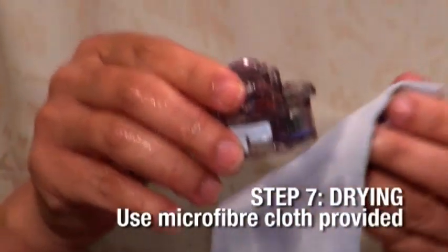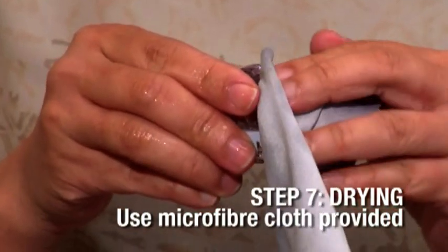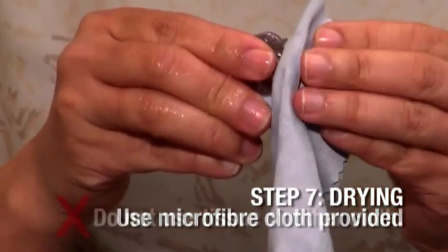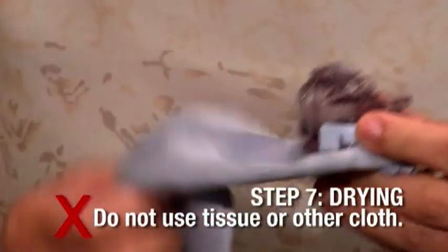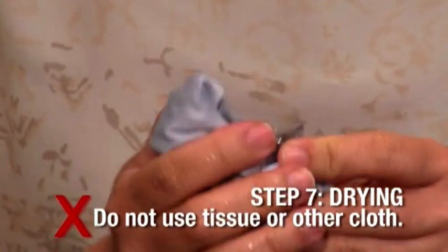Dry the parts after washing. Wipe with the drying microfiber cloth provided. Do not wipe with tissue or other cloth, as that may leave residue in the mesh, clogging it.